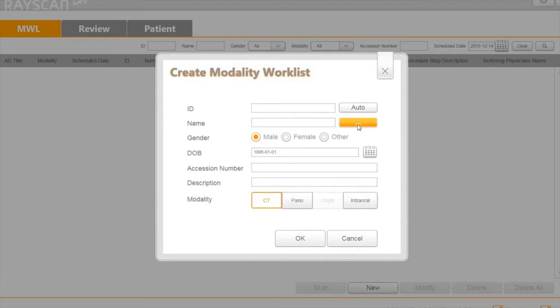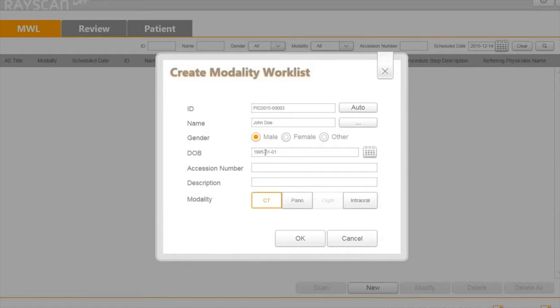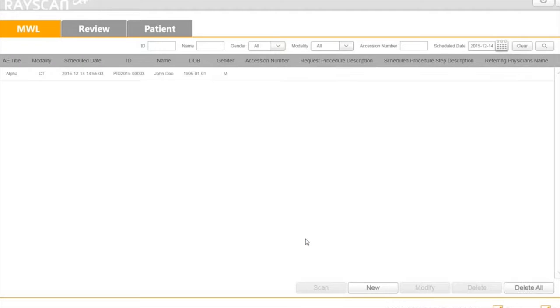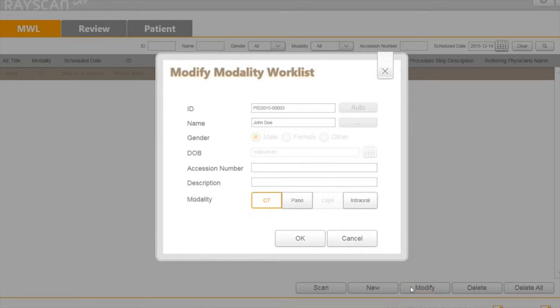In this option, you can make your own worklists. You can also modify the information, such as modality.